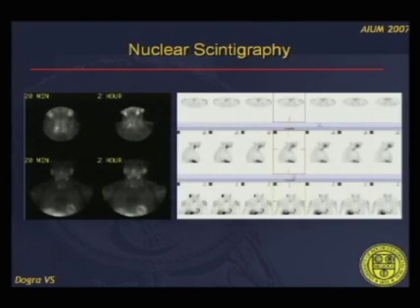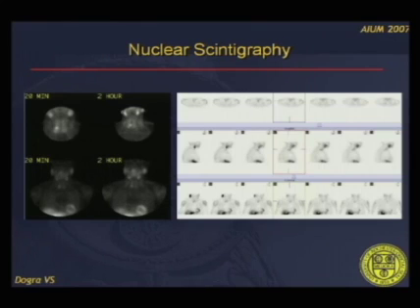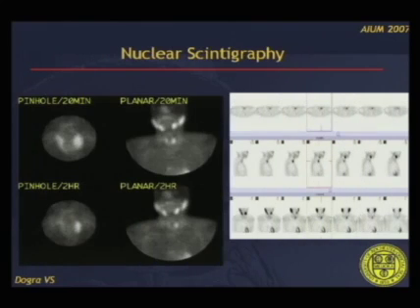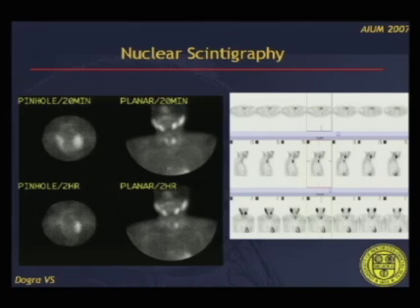This is an example demonstrating the presence of an ectopic parathyroid adenoma. In this additional patient, a pinhole 2-hour image on the left shows the parathyroid adenoma very clearly — pinhole images are useful to improve the resolution of these images.